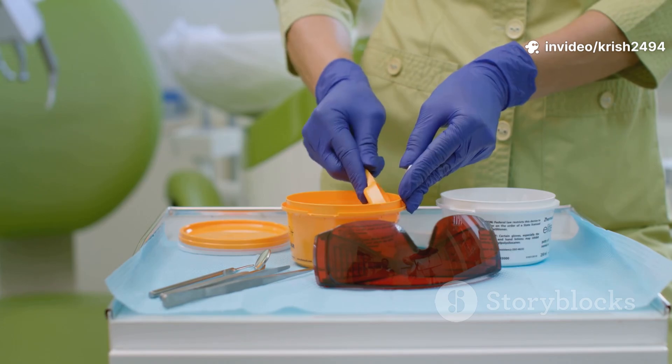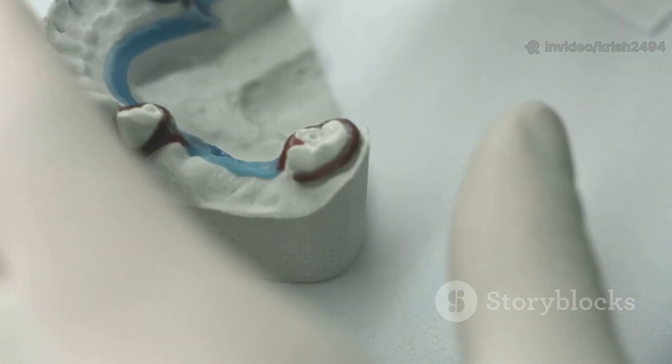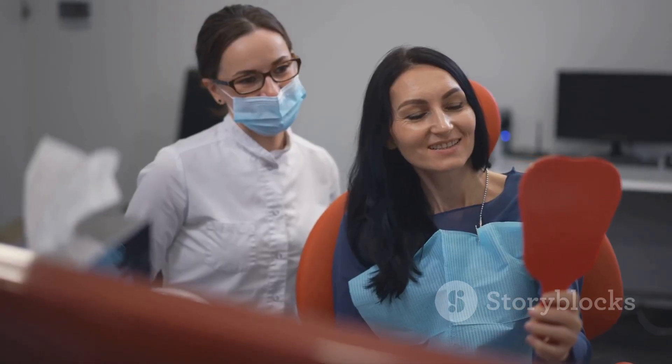Denture insertion is when you finally get your new teeth. The dentist checks the fit, makes sure there are no sore spots, and adjusts as needed. You leave with your new smile in place.